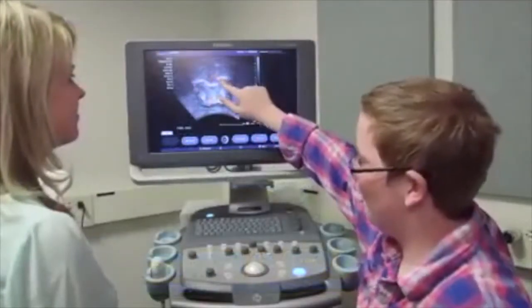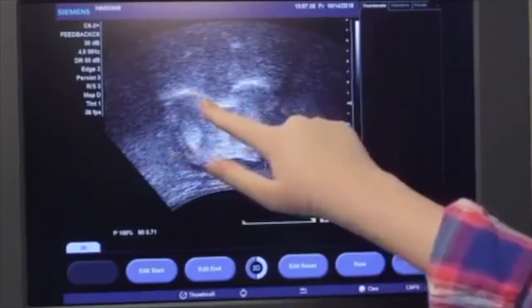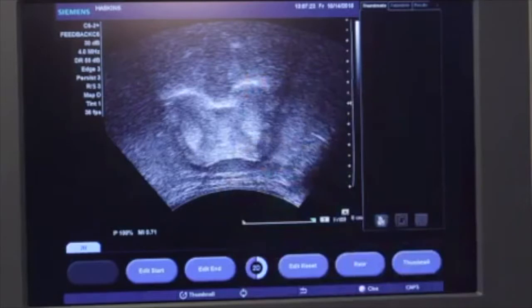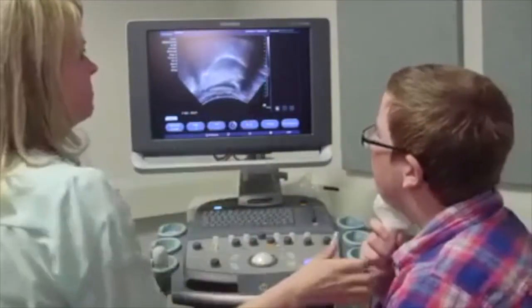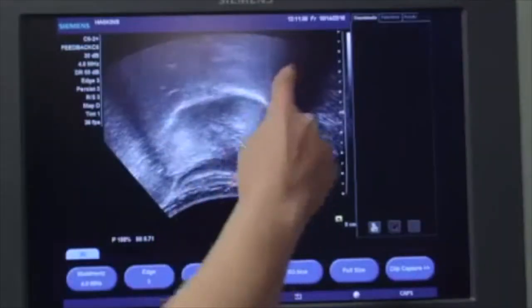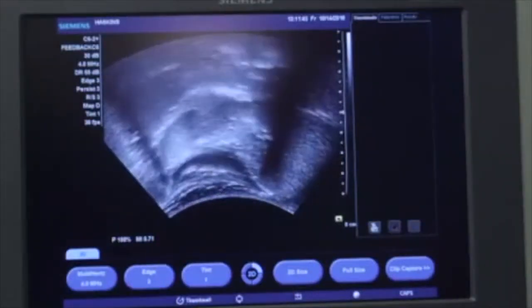Ask the participant to trace the tongue shape, identify the left and right edges, identify the center line groove, and explain the desired shape. Have the participant attempt to produce correct R in isolation or in syllables by providing phonetic cues to copy different tongue shapes.